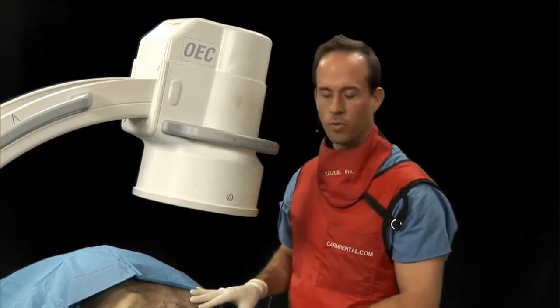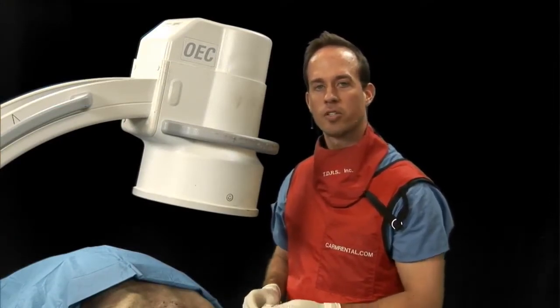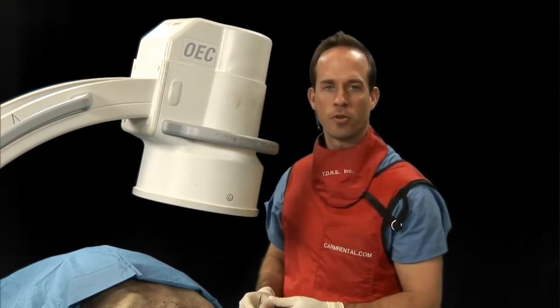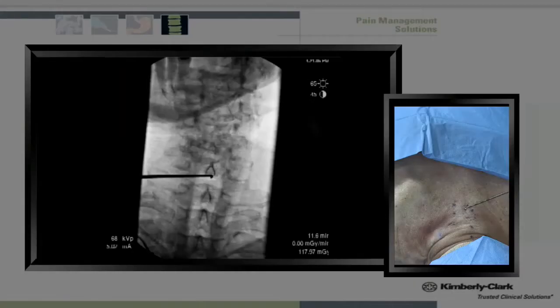In this procedure that we are demonstrating today from a posterior perspective, we have additional value in the fact that we have a bony backstop that gives us further safety when we do our RF procedure.